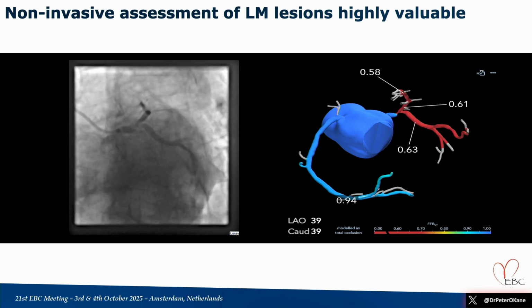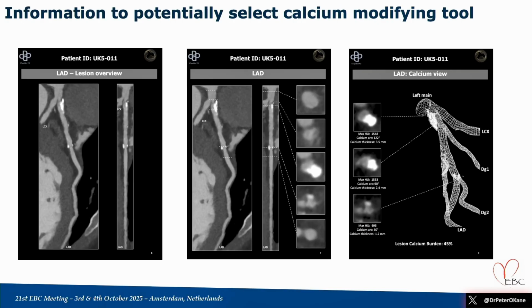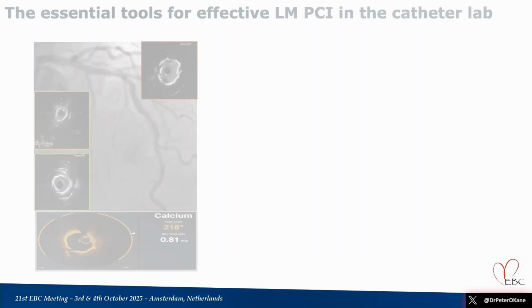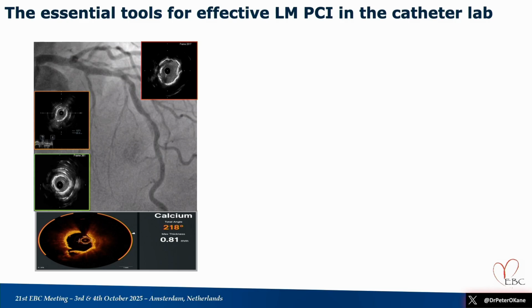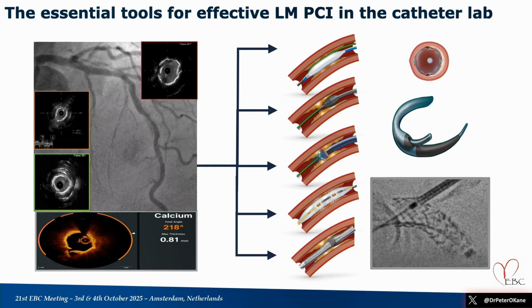Because I think in a world where some of the cases may be becoming more complex, but some of the newer doctors have less access, we need to be able to train. And that's from Carlos's P4, we get some incredible information. But then when we get into the cath lab, we need all the information we got, and we need all the tools. As well as atherectomy, we need cutting balloons, we need dual lumen catheters, we need enhanced X-ray.